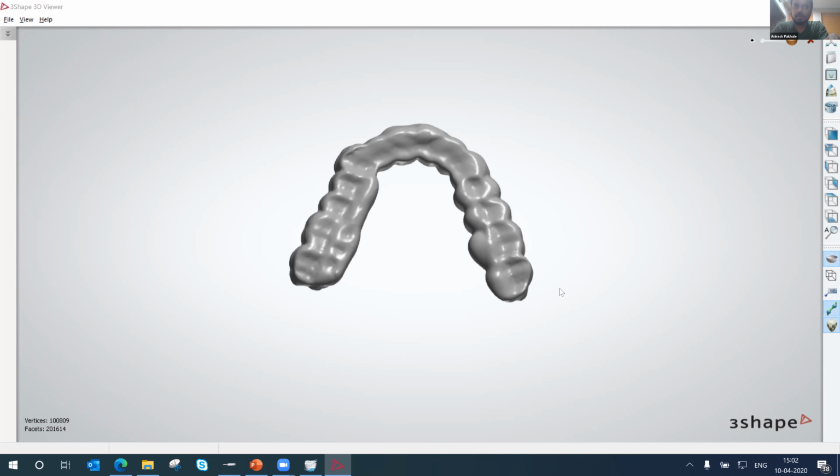Namrud Alkan asks: first, I have set a material in configuration, but in splint mode I can only choose 3Shape material. Second, we set a construction DSCAM version 3. Where can I set it to save the construction file in our network folder? Okay, Namrud, I feel like this question could be asked to support, since it includes some CAM divisions and everything. So I would prefer this go to support. I guess support can answer it in a better way.